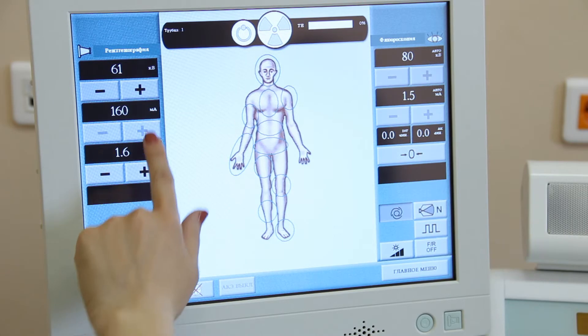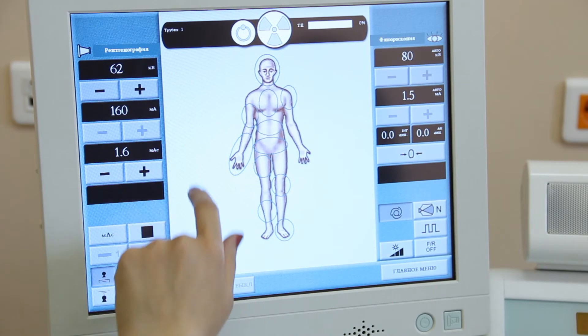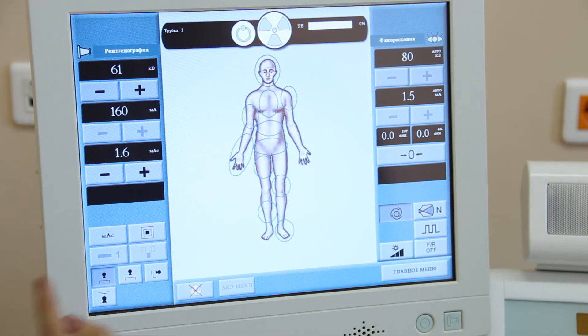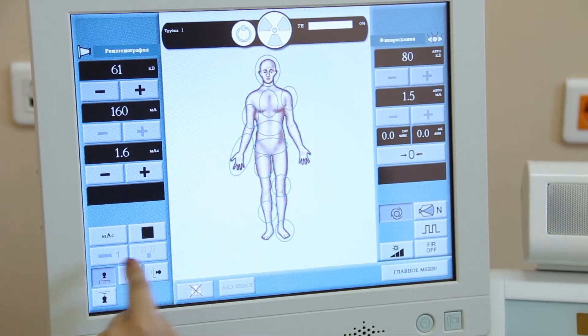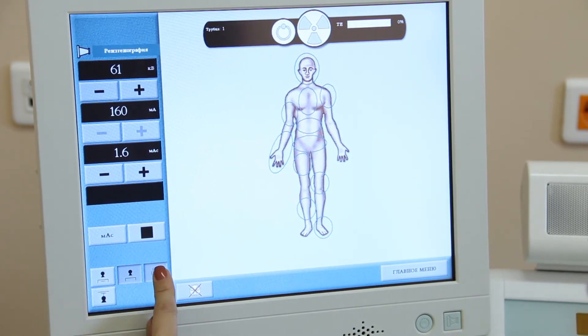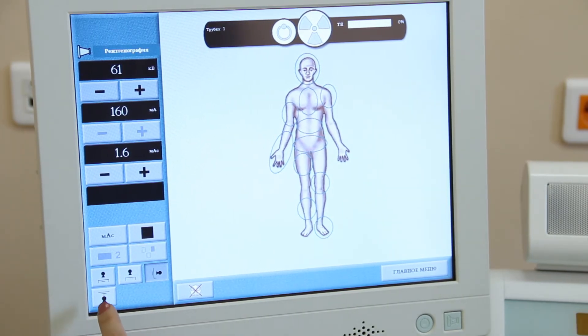An operator may adjust settings manually to get the optimal mode. Automatic exposure control enables obtaining high quality images with minimal radiation dose.